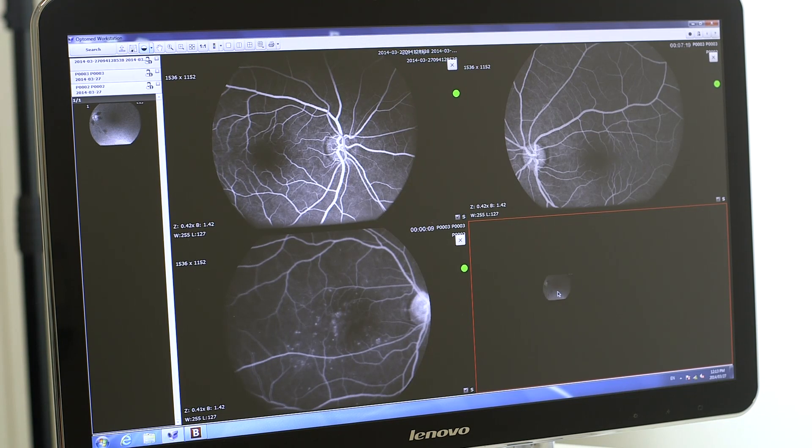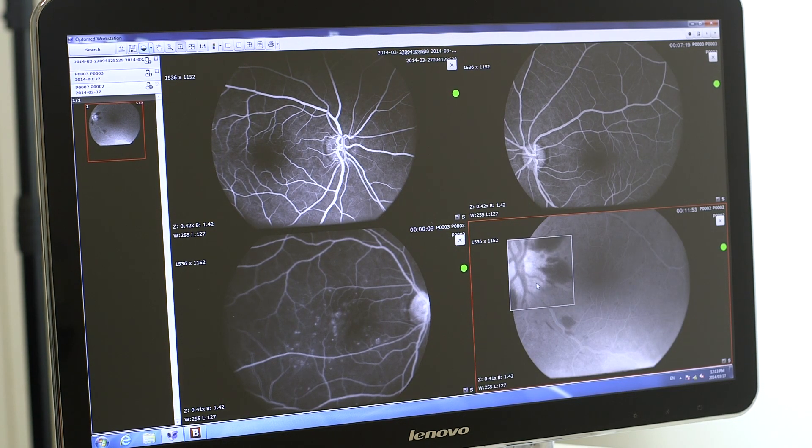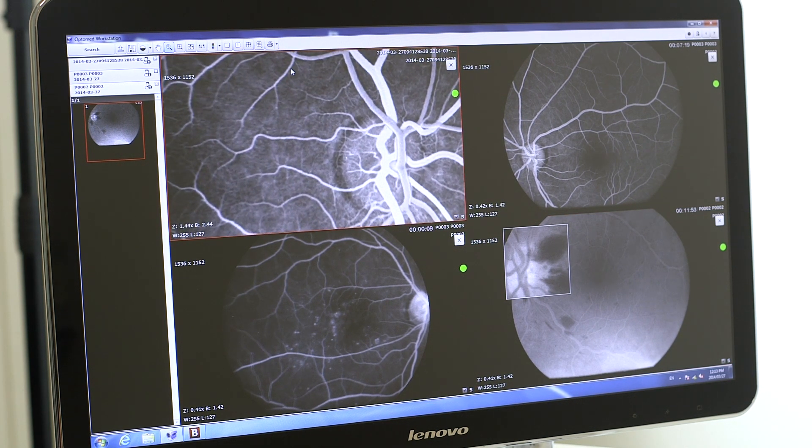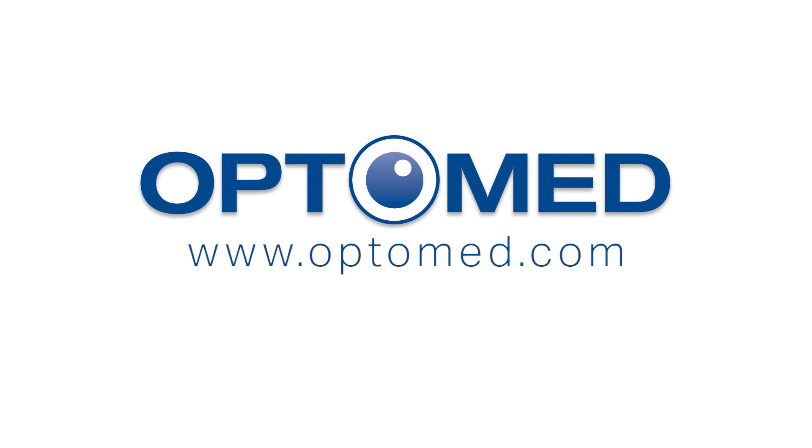With Optomed Workstation software, the transferred images can be viewed, analyzed, and compared with one simple graphical interface and sent directly to the DICOM-compatible system of the hospital network. If you need more information, please visit us at www.optomed.com.